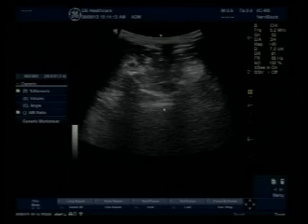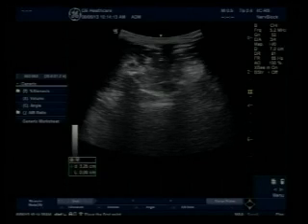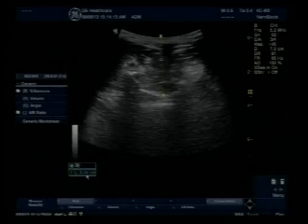And now let us measure the depth of the epidural space. From the yellow triangle in the middle of the screen towards the green arrow, which is the first hyperechoic line, is the ligamentum flavum and dura complex, this posterior complex. And in her, she's a very thin patient. You are finding it at 3.44 centimeters, which is probably expected in her body habitus.